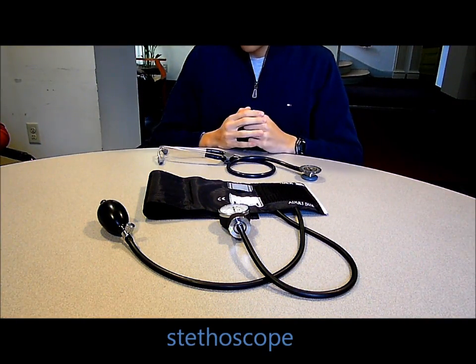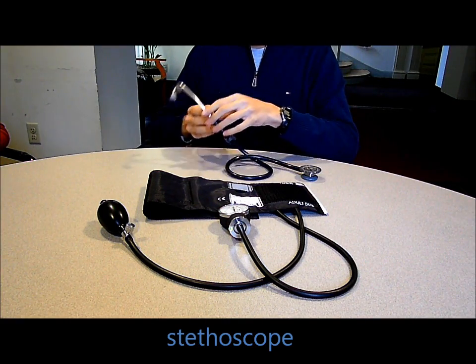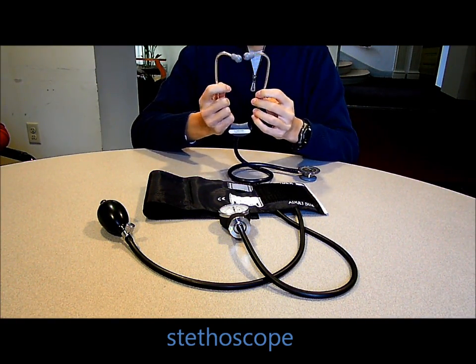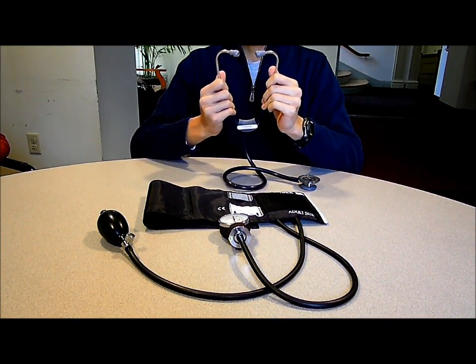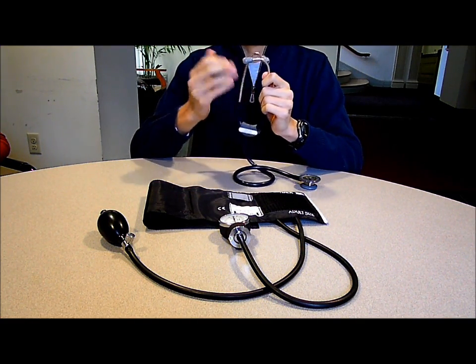This is a stethoscope with a similar design to the ones that you will be using in your screenings. The stethoscope has two earpieces, which should be twisted at a 15-degree angle. The earpieces of the stethoscope should be pointed away from your face, so that when they insert into your ear canals, you can achieve a tight and snug fit.